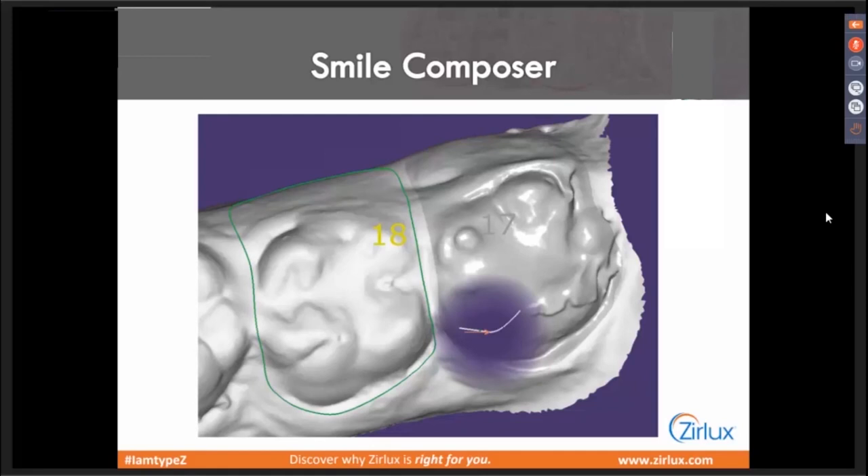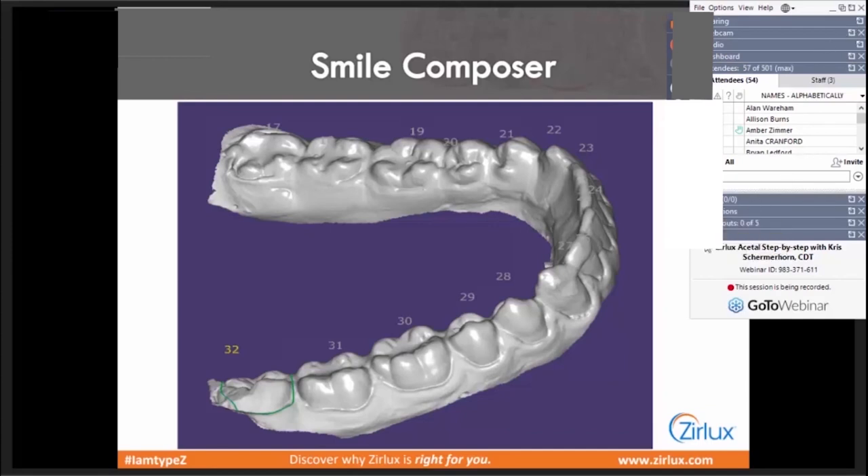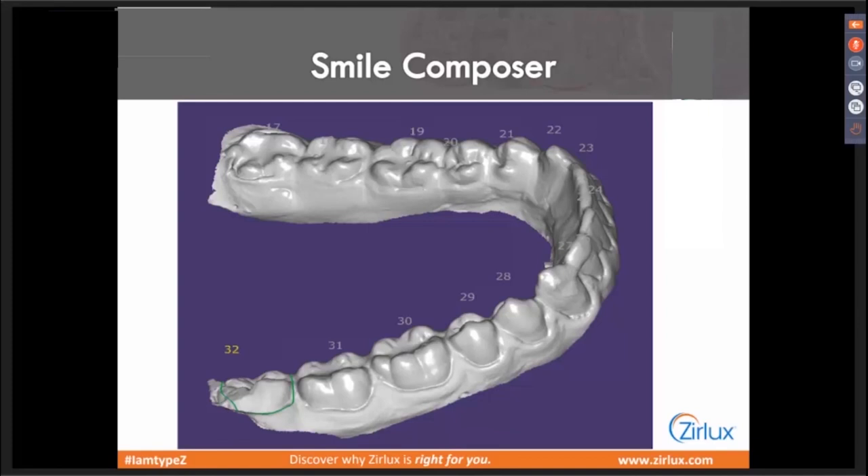Previously, even before scanning your model in, consider blocking out some major undercuts with wax to help the software out before you load the scan in. Once you've marked all your margins, I'll extend on the lingual for strength as well as to help the software deal with undercuts — a few millimeters below that lingual margin. On the buccal, I'll go right down the margin, slightly overextend so I can finesse that with a handpiece after the fact. During design, it's going to do some goofy things, but you can work with that by blocking out and overextending margins to really help that software out.